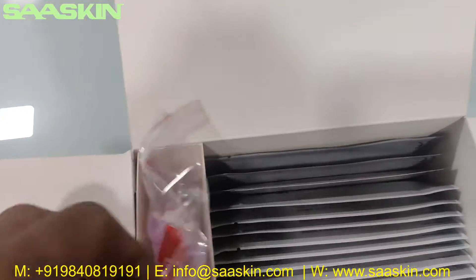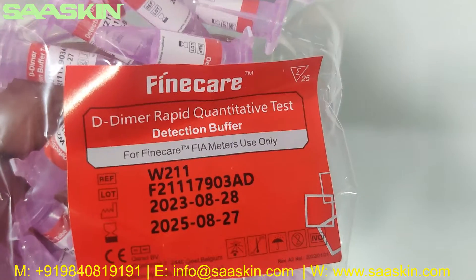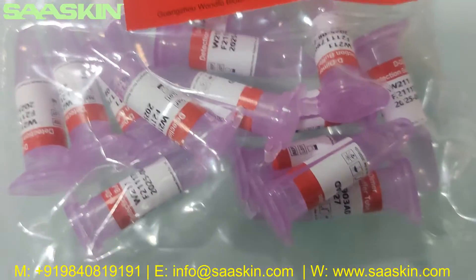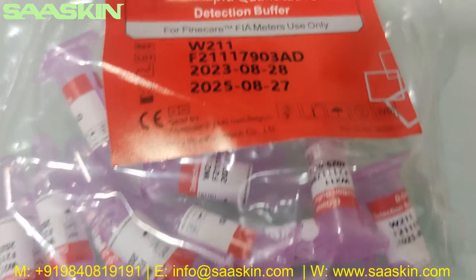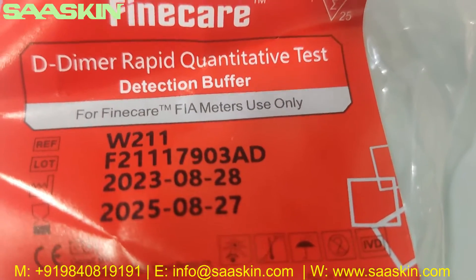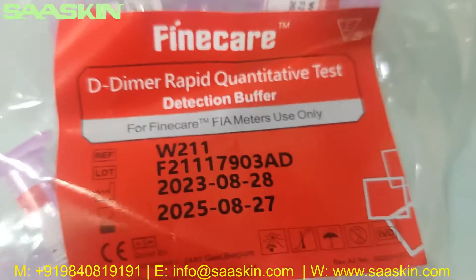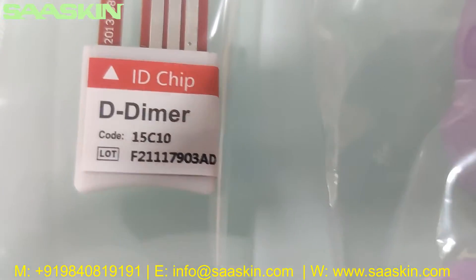Further inside, you can see there are 25 individually packed D-Dimer Rapid Quantitative Test dilution buffer tubes — you get 25 pieces of the buffer. Each has the lot number and expiry period. It is important that the lot number on the dilution buffer matches the lot number on the test cartridges and also on the ID chip.